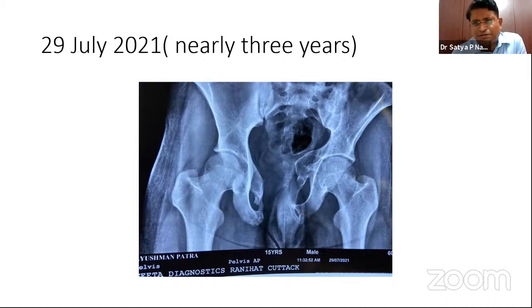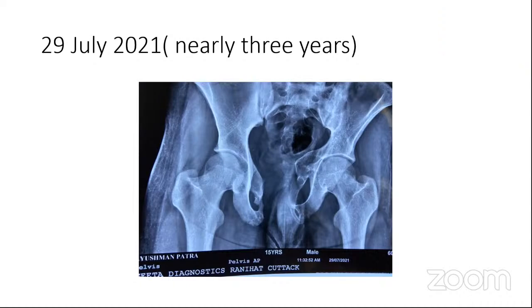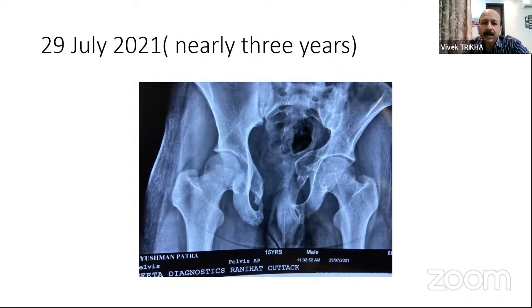They have done. Very likely, because till 1 year he wasn't having an SPC. Till that time it looks okay. And once that SPC has come out, I don't know. I can easily blame the urologist for that, because it looks as if they might have cut from there and gone there. You don't know what exactly they would have done. But it is possible that if they have intervened from an anterior approach, some infection has happened, because if it had to be there, it should have been there in the first year. That's what I could gather from the X-rays and CT scan.